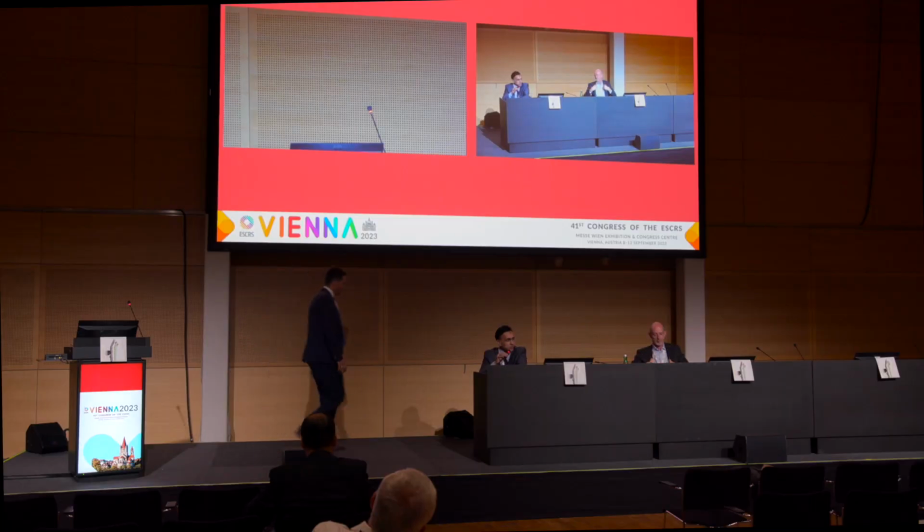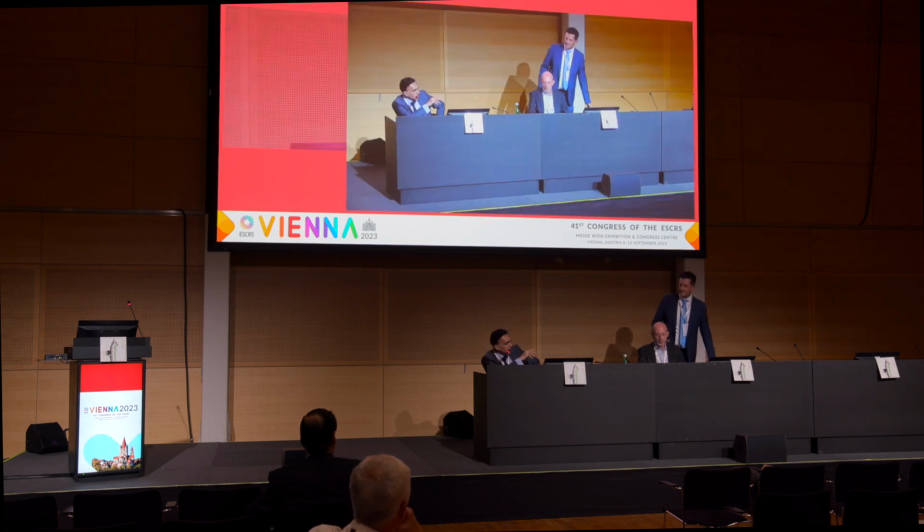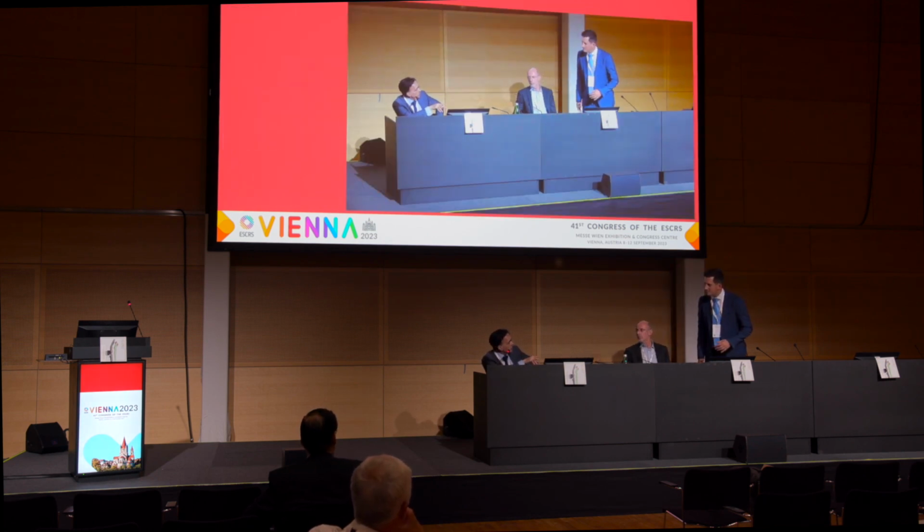Thank you. That's very interesting. So I'm just going to ask you a couple of questions from the talk. I know the study went out to basically 2 months, and you showed the lens picture with the segmental focus there. One of the things I was going to ask you is about stability of that lens. Rudy mentioned the positioning of the lens when you implant it inside the eye, basically superior inferior with the segment on the inferior side. Do you think that's potentially an issue? Because of course that's where they're focusing for the intermediate and near. And if so, is there anything that you do to mitigate it, or is that something you're going to look at in the long term, especially if you get capsular fibrosis occurring?